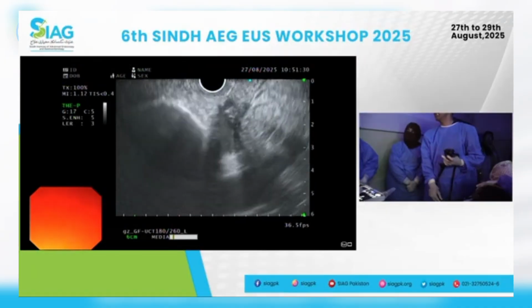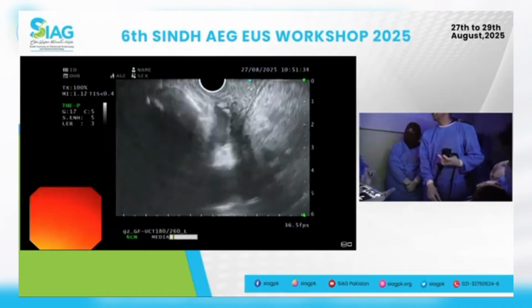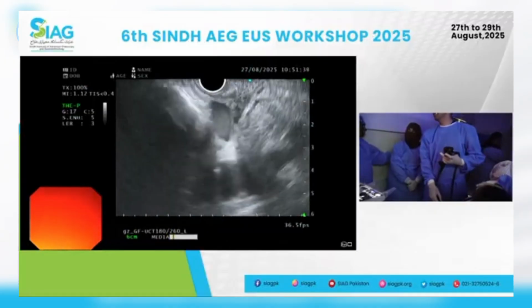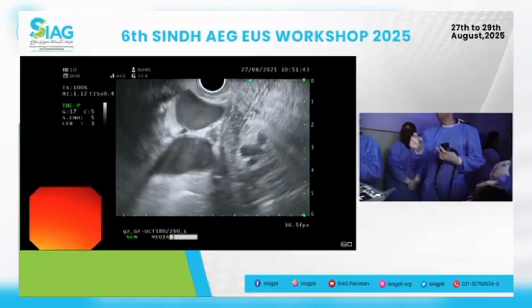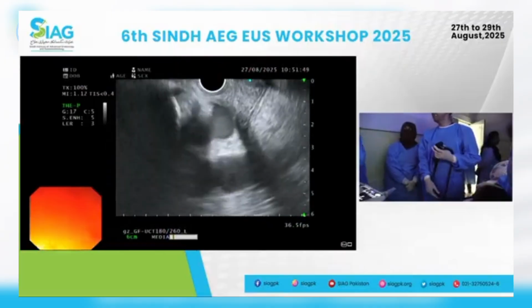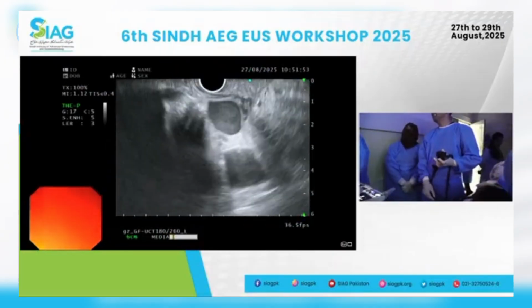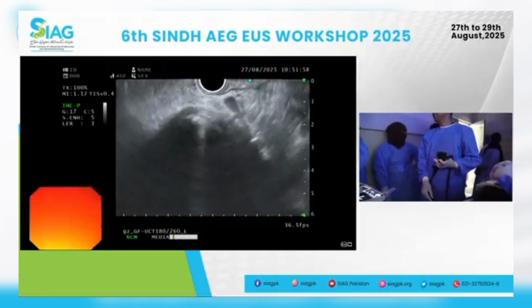Okay, so slowly withdrawing, withdrawing, withdrawing. We're just focusing. I think we're falling back in again. It's fine. It just happened. That's absolutely fine. See, slowly withdraw. That's always a possibility.